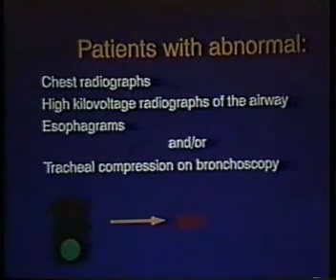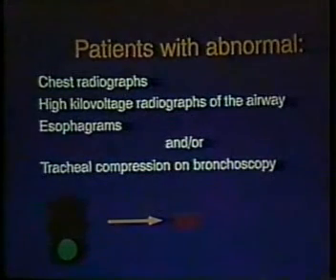This is because of MRI's ability to image at extremely high resolution in all planes with large fields of view and no ionizing radiation.